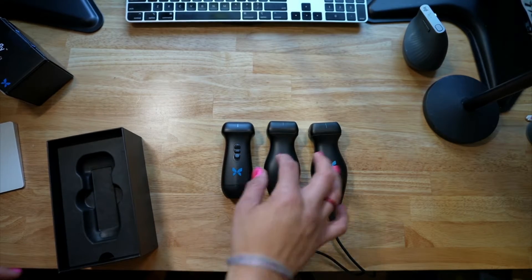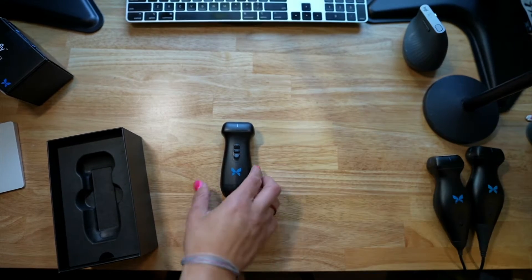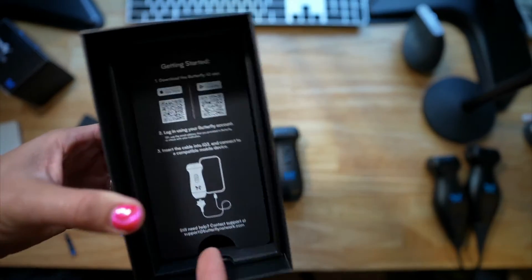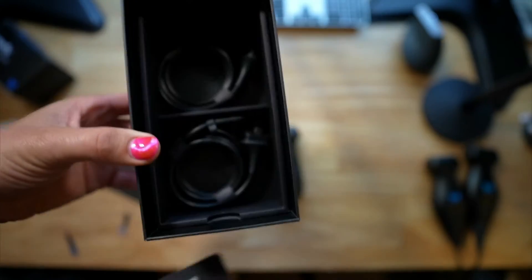Let's look at the other things in the box. We have the instructions on how to download the app, which is nice. And we have our charging cables.